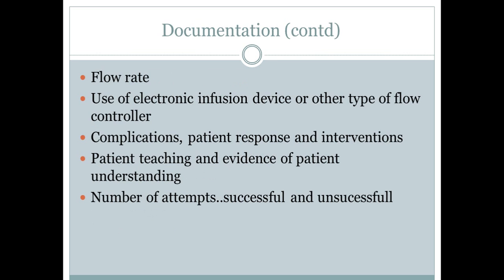Other things I would document is that flow rate if I have that continuous bag going. And I'll give you an example here in a minute. I'm also going to document if there's a use of an electronic infusion device, if it's hooked up to the pump, or it's hooked up to gravity. Any complications. Did the patient move? Did the patient pass out? Did the patient get faint? As well as any nursing interventions that I did.